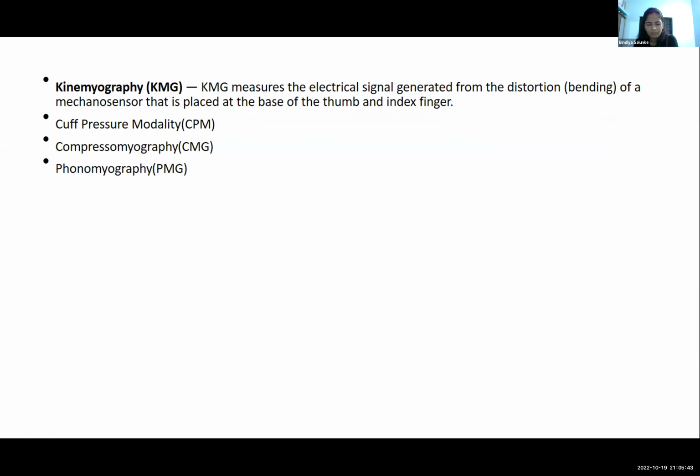Electrodes are integrated into the blood pressure monitoring cuff and stimulate the brachial plexus, which causes bulk contraction of the upper arm and generates pressure, which is calculated from the change in the blood pressure, and this is analyzed and displayed. Next are compressomyography and phonomyography. Phonomyography measures the intrinsic low frequency sound of the muscle which happens during contraction, picked up by a microphone following the nerve stimulation. These last 3 are under evaluation, not marketed.